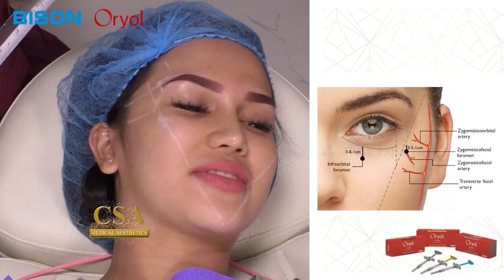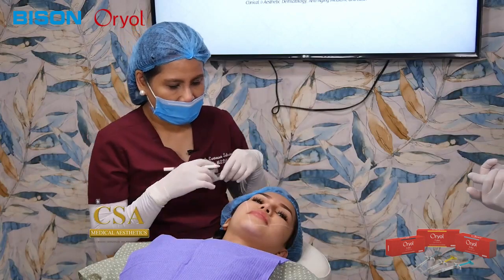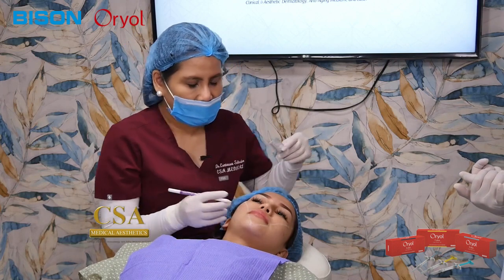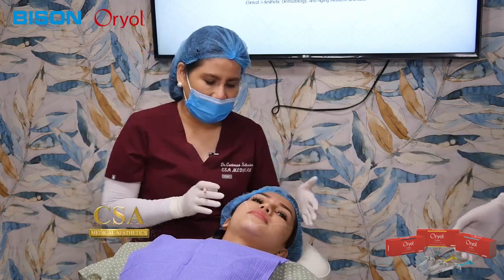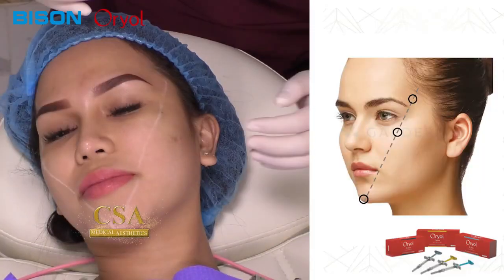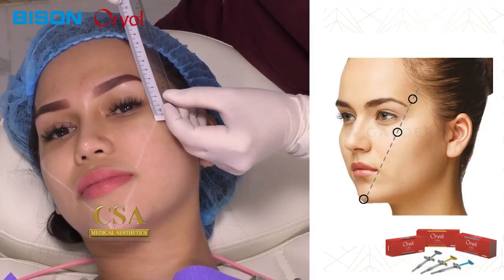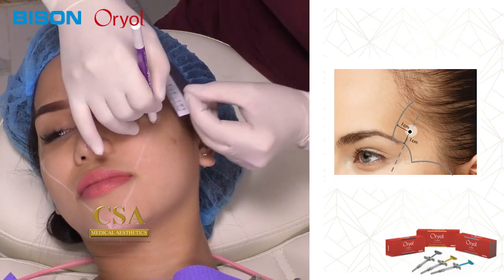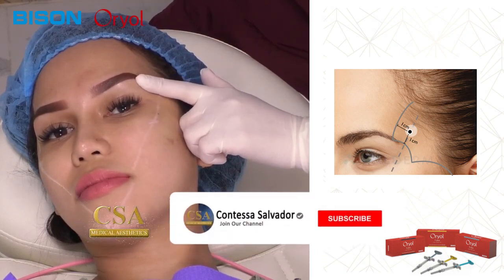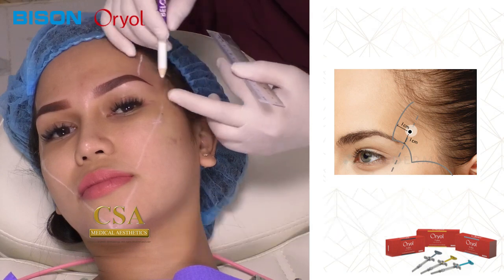So, to correct volume loss and improve depressions, hollowness, or sunken areas, we need a filler. And the filler that we will be using is, of course, hyaluronic filler. Hyaluronic, as we all know, is naturally present and very safe and well studied. We have already done a lot of hyaluronic injections all over the world, and there have been a lot of papers and scientific reports on this kind of treatment. Right, Kim?